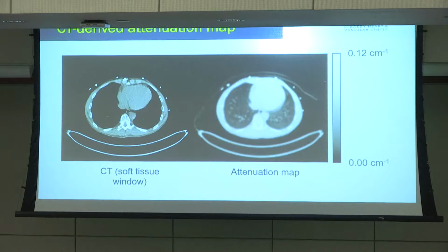Now some people ask, what do we need to do attenuation correction? You need an extremely low dose CT. That's why the CT that's usually attached to the nuclear cameras, at least the SPECT ones, like our machine, is only a 2-slice CT. You can do it with a radiation dose equivalent to 4 chest X-rays, PA and lateral.